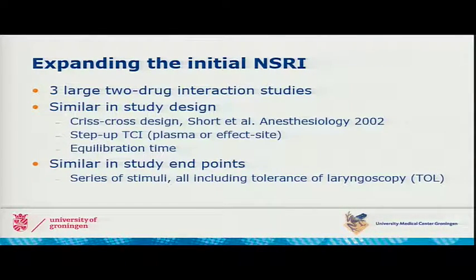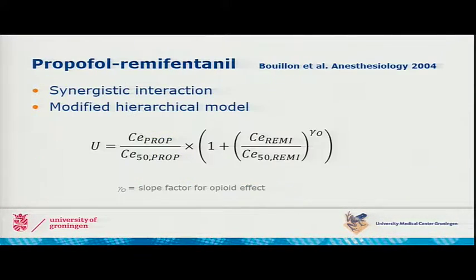sevoflurane-remifentanil interaction study. So in the past years, 3 large 2-drug interaction studies were performed, which were similar in study design, namely the crisscross design, and also with similar study endpoints, with usually a series of stimuli, but all of the studies including tolerance of laryngoscopy, which is of course important for the NSRI. And for all studies, the intravenous drugs were administered using step-up target controlled infusion, with an equilibration time of 12 to 15 minutes to ensure equilibration between plasma and effect site concentrations.